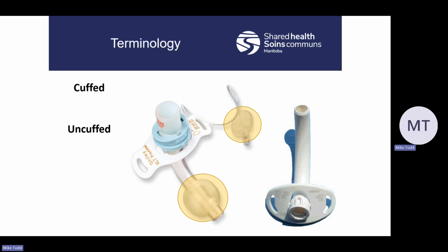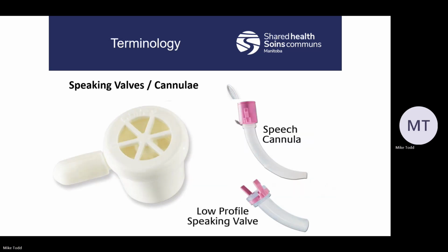With an uncuffed tube, they may be more long-term at home. But again, the difference is you do not have a cuff on that one. When it comes to speech, it's very difficult to speak when patients have tracheostomies.